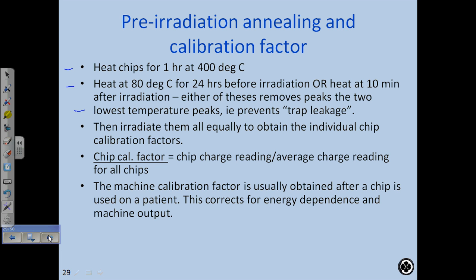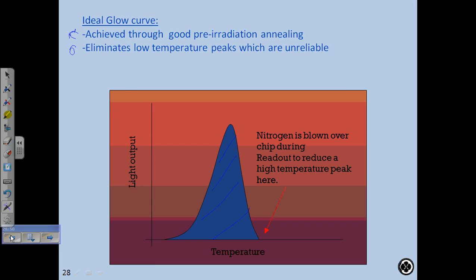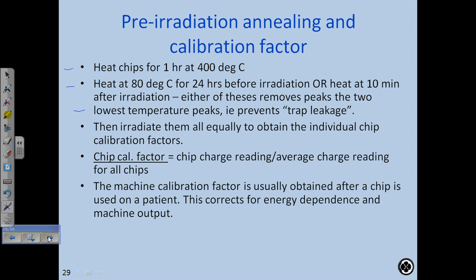And then you irradiate them. Usually there's a metal holder, and all the chips are sitting in there. We used to have 100 chips at a time. So we had a metal holder that had been drilled out with little indentations, and we put a chip in each indentation, and then we cover it with another metal piece, seal that up, and put it in the ovens. Then we take them out of the ovens, and then we take each chip and put it on a piece of polystyrene that also had indentations.